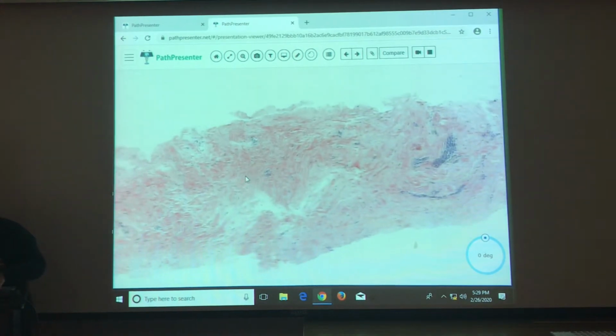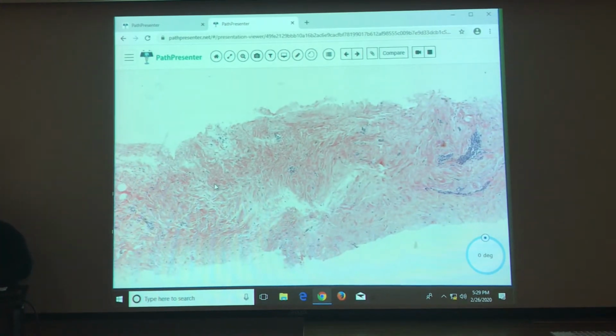You can use your cheat sheet if you want. Do you have any ideas?